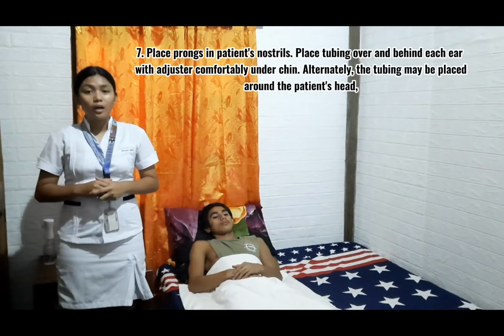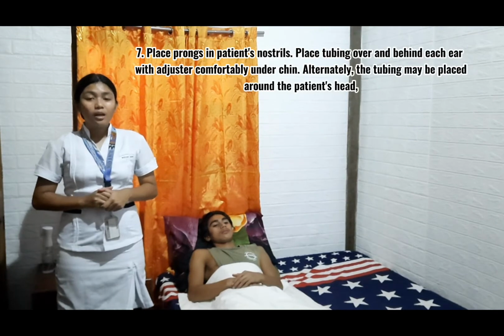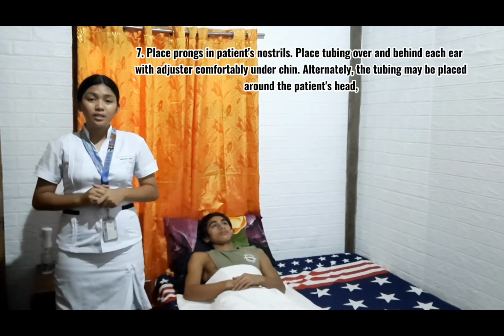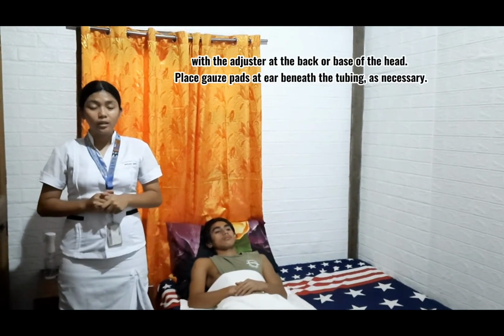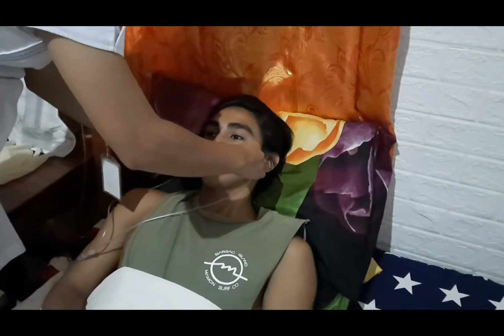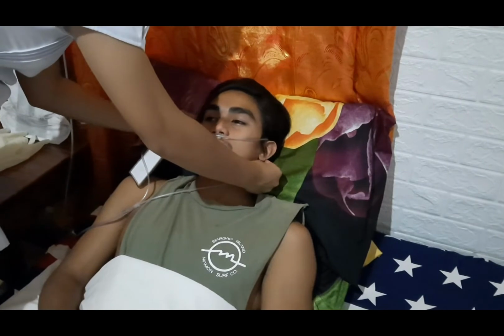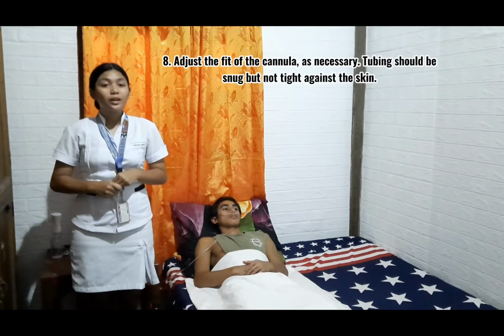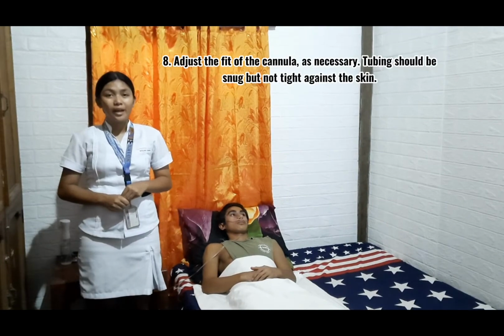Place tubing over and behind each ear with the adjuster comfortably under the chin. Alternately, the tubing may be placed around the patient's head with the adjuster at the back or base of the head. Place a gauze at the ear beneath the tubing as necessary. We need to adjust the fit of the cannula as necessary. Tubing should be snug but not tight against the skin.